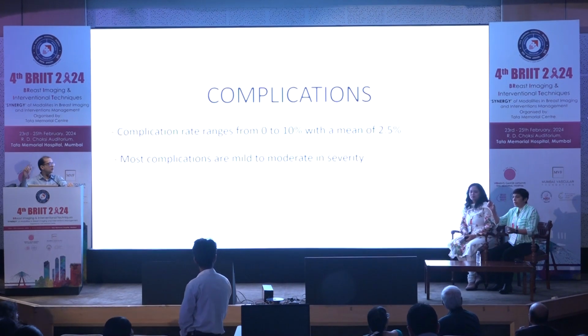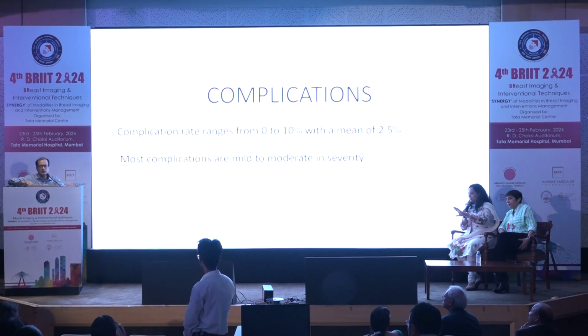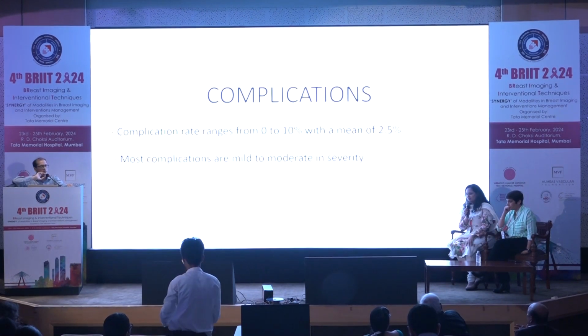And on ultrasound, you can see some defect, but if it is a very small lesion, you wouldn't. So that is a practice that I do. I don't take my hands off the breast.